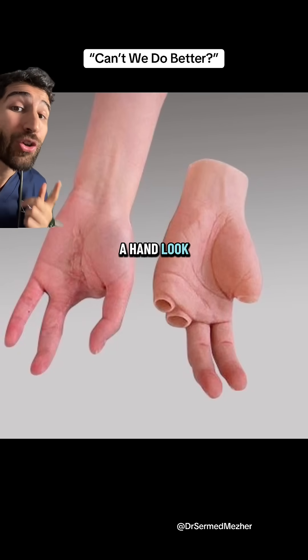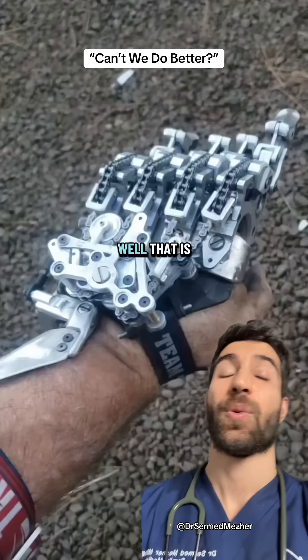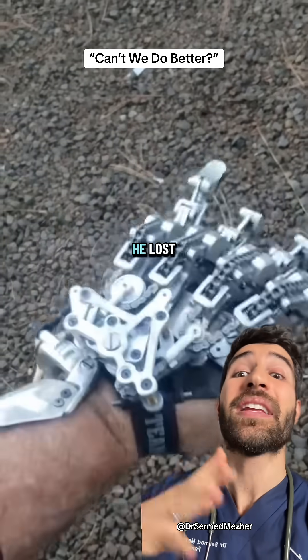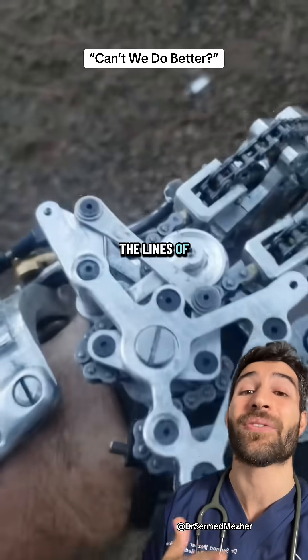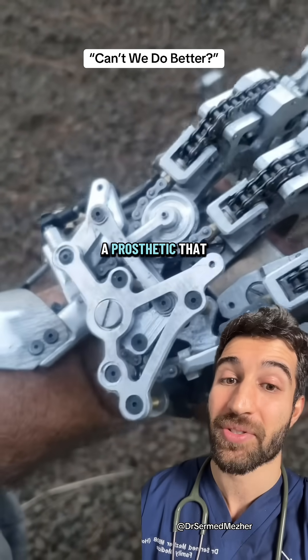Silicon prosthetics are good to make a hand look more normal, but in terms of function, can we do better? That is exactly the question that mechanical engineer Ian Davis had after he lost four of the fingers from his left hand. He recalls his insurance company saying something along the lines of that fingers are a luxury, rejecting his application for a prosthetic.